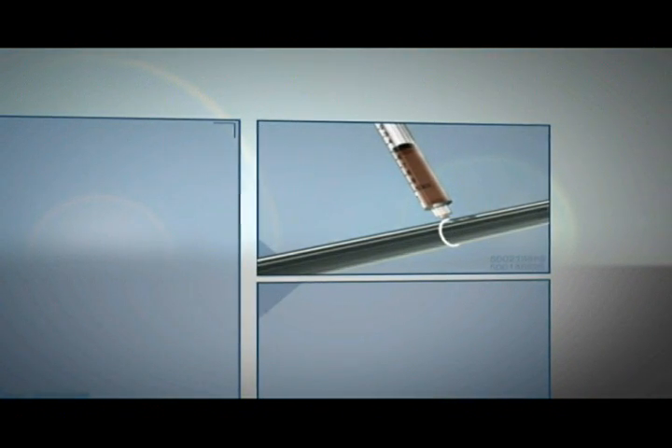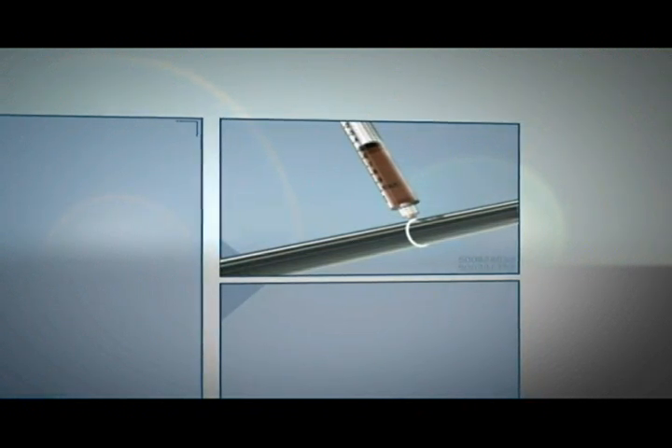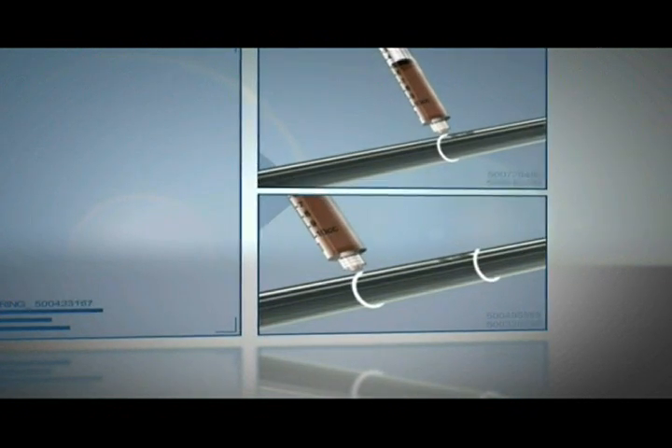A medically approved UV adhesive is then dispensed onto the catheter. As the catheter rotates 360 degrees, the adhesive is applied at both ends where the balloon will be placed and bonded.